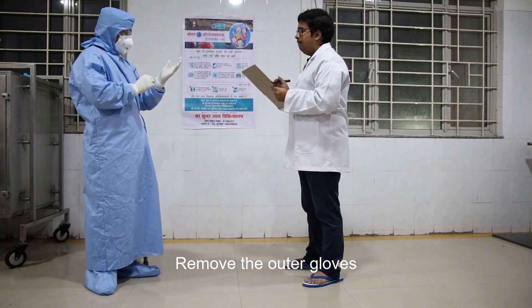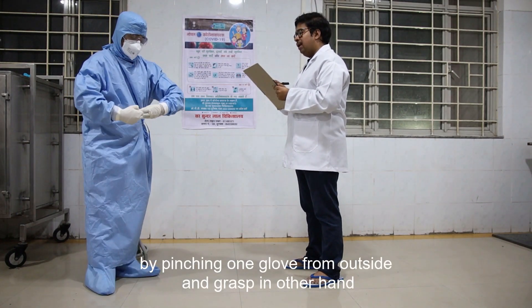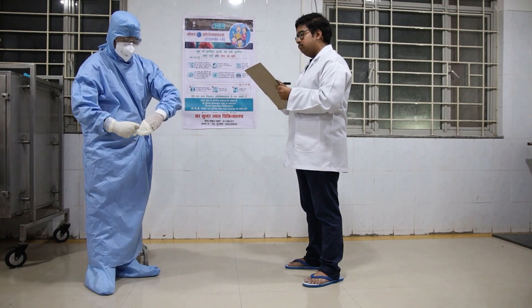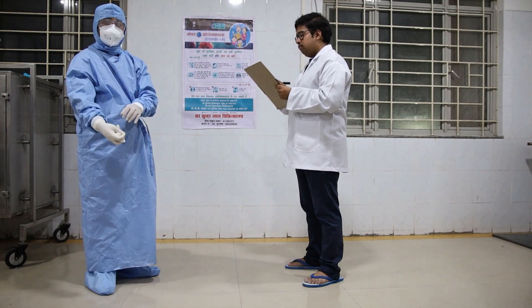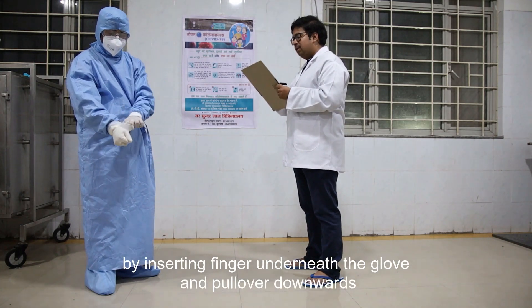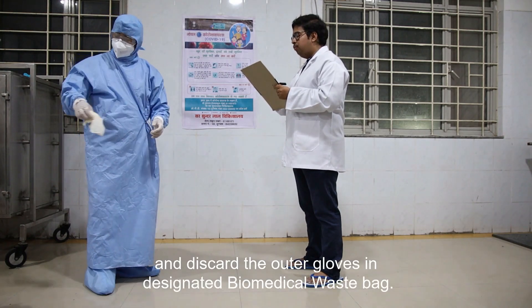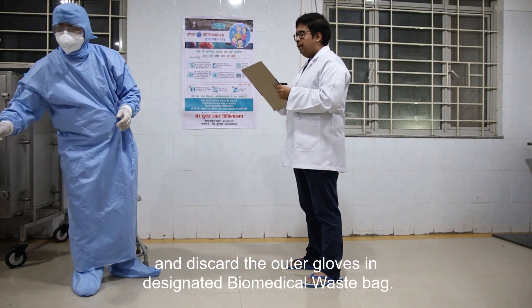Remove the outer gloves by pinching one glove from outside and grasping it in the other hand. Then remove the other glove by inserting a finger underneath and pulling it downward. Discard the outer gloves in the designated biomedical waste box.